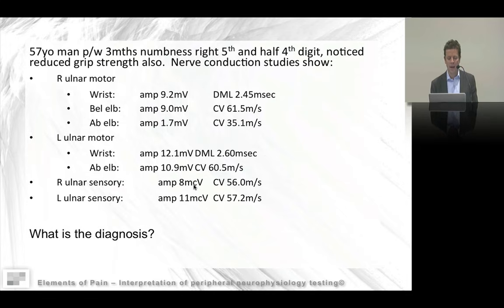The reason there's numbness is much like the motor conduction block here. If we did a sensory study ascending up the arm, we would also likely see a similar feature. You don't see conduction block in sensory studies like that, but what you will see is focal slowing. So essentially responses aren't getting through the elbow. The nerves are intact, but because there's demyelination, a loss of saltatory conduction, basically the responses don't get through and there's numbness, even though the wires themselves, the axons, are fine.